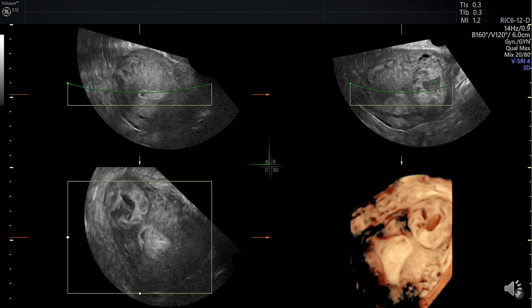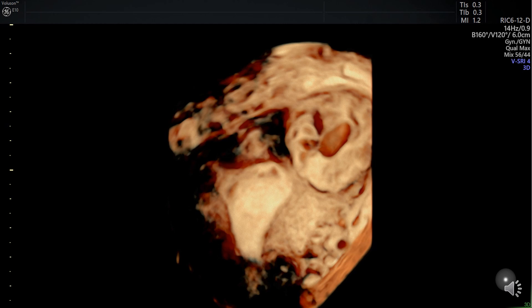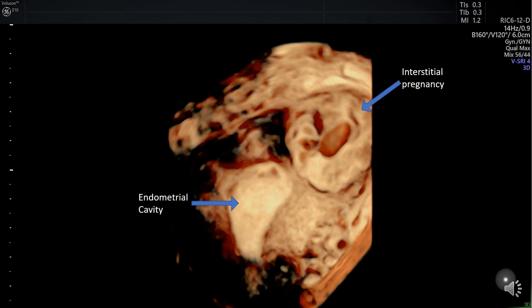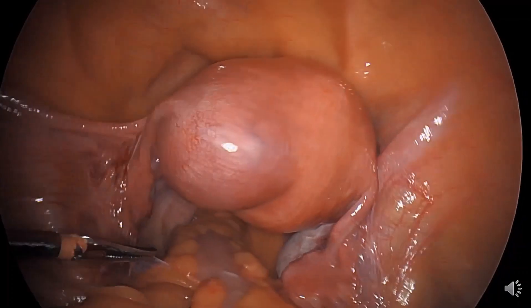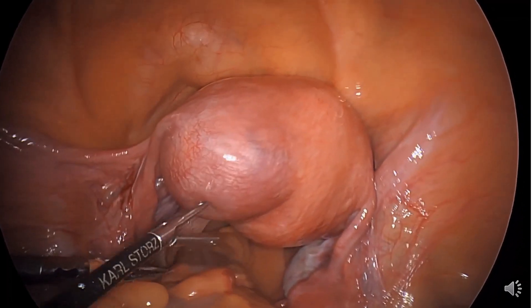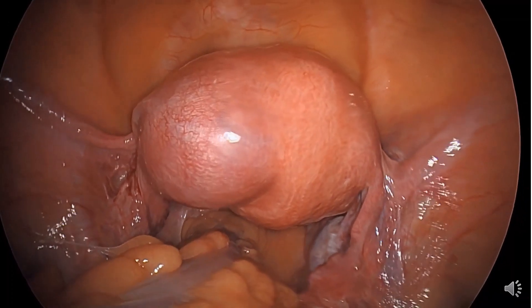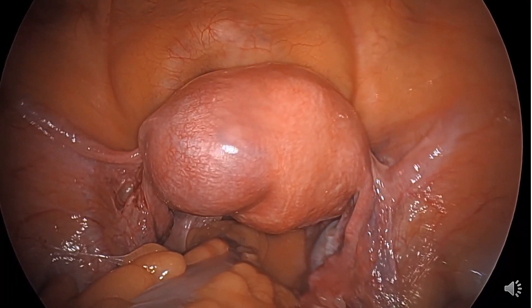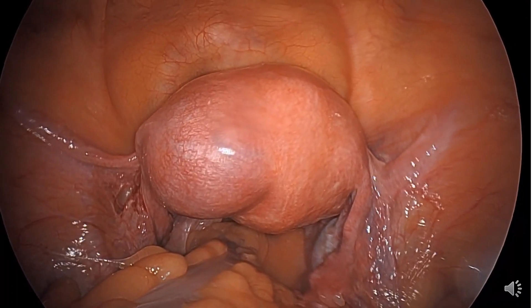With advancing technology, 3D ultrasound has shown to be a significant imaging aid, increasing sensitivity and specificity for the diagnosis of an interstitial pregnancy. Notice the pregnancy and the endometrial cavity marked by the arrows. This video clip shows the correlation between the sonographic findings and the surgical findings, completing the definitive diagnosis of an interstitial pregnancy.